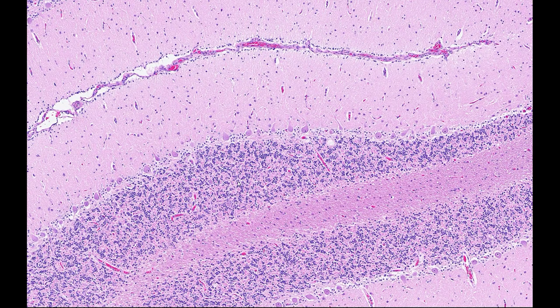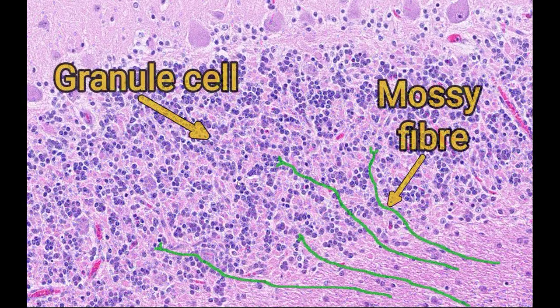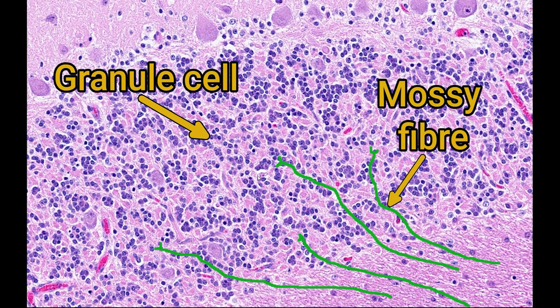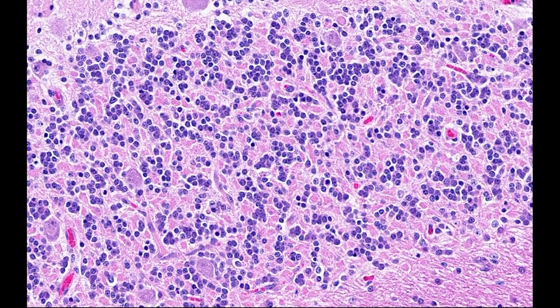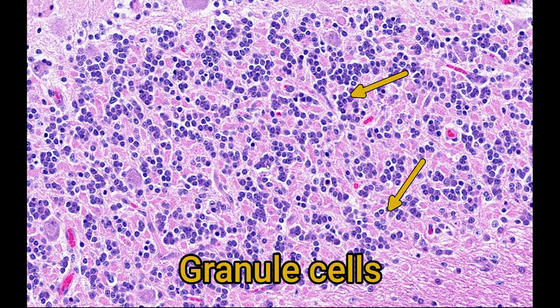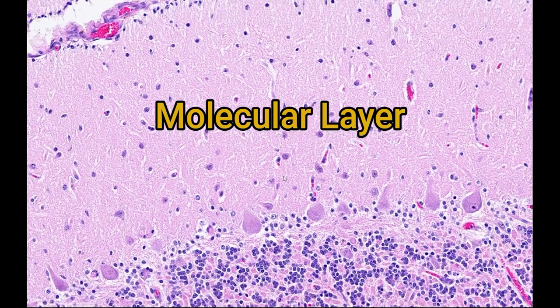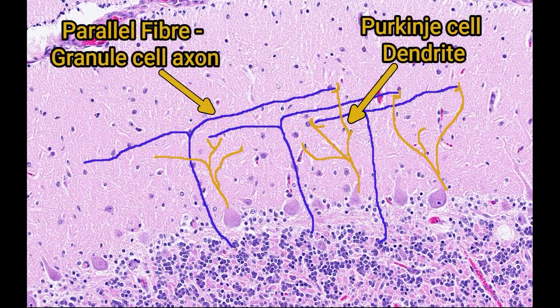The mossy fibres synapse with granule cells in the granular layer. Most cell nuclei that you can see in the granular layer belong to granule cells. These are the smallest and most numerous neurons in the brain, so all of these dark little nuclei with little cytoplasm belong to granule cells. These granule cells then send axons up through the Purkinje cell layer to the molecular layer, where they synapse with dendrites from the Purkinje cells. These axons are known as parallel fibres because they often head up into the molecular layer and then branch out parallel to the layered structure of the cortex.